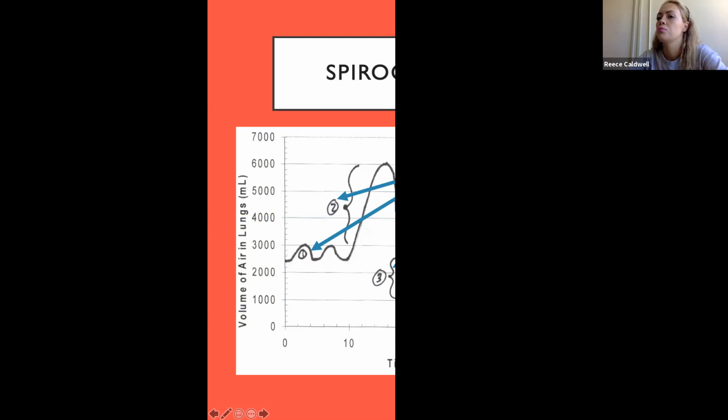And then the description is pretty important. So number 1, we have that tidal volume again. It's sometimes called quiet breathing. So if you ever hear Dr. Chang refer to quiet breathing, he's talking about tidal volume breathing, just normal breathing. So inhale, exhale, inhale, exhale. Then they tell you to take a really big breath in so we can determine how strong your lungs are. And so 2 is that inspiratory reserve volume. So inhale, inspire, that is number 2. That big breath.